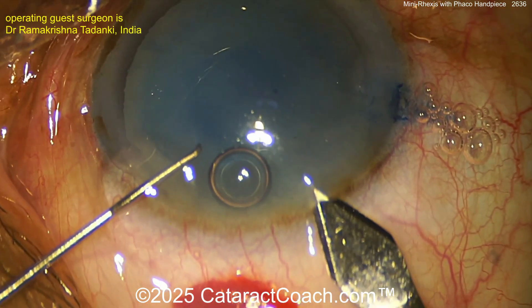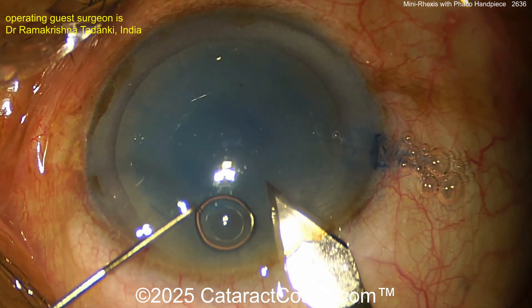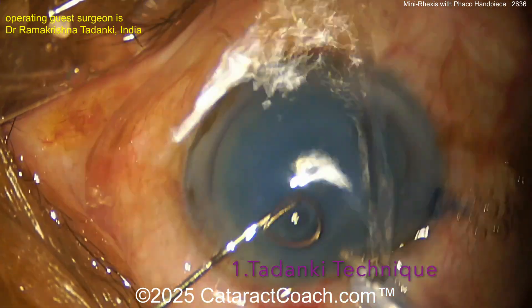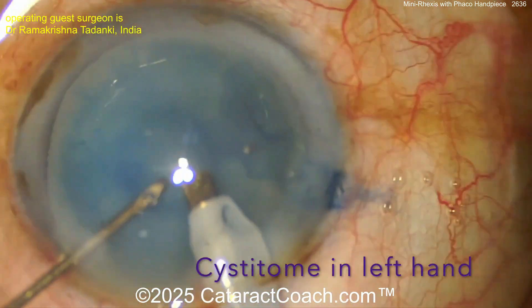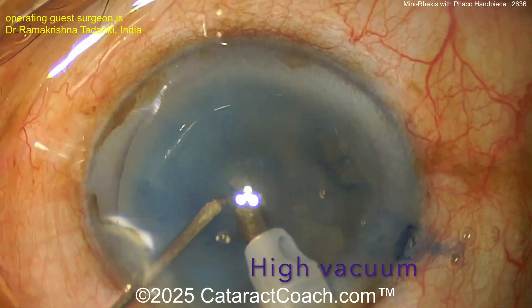Everything looks routine here. The main incision is being made, and the technique involves using the phaco probe with suction. The phaco is not in phaco mode — it's in IA (irrigation/aspiration) mode.